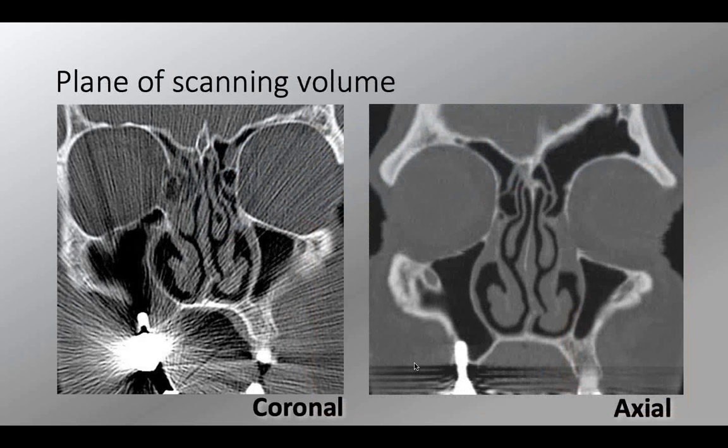And the next is, if you do coronal imaging, you will have a lot of artifacts into the sinuses. So this patient had to come back and do a new CT examination with axial scanning volume. And this time it looks quite nice.